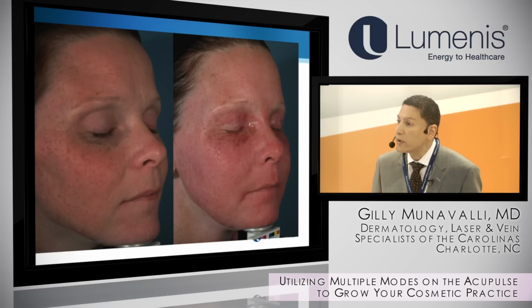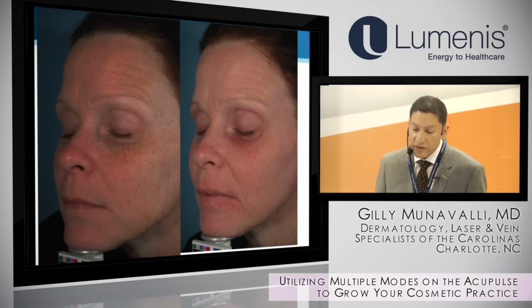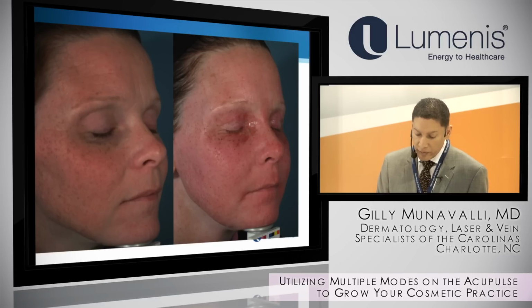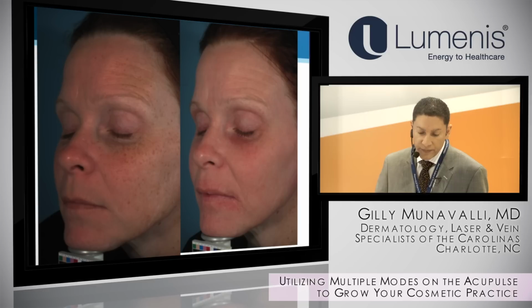So this is another patient of mine with just the combo mode. You can see where we've gone deeper around the eyes, a little bit around the mouth, more superficial in other places, but you can see a really good result here. And of course, when you get more aggressive, so when I turn up the energy on the deep, you'll see that it's more erythema, but that resolved. So what I would typically do with the combo mode, you don't have to go back. You don't have to really do 2 passes anymore. So a single pass to this area, a single pass to all these areas. I would do a double pass here using the deep and then the combo mode at a lower setting, and so that's where you get the flexibility in changing your parameters.